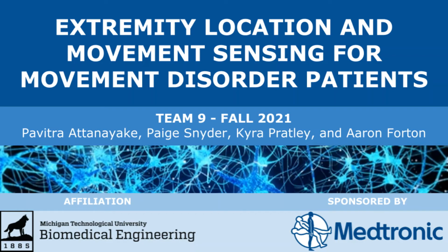Hello, we are Team 9 of Michigan Technological University Biomedical Engineering Department's senior design teams. Our project is titled Extremity Location and Movement Sensing for Movement Disorder Patients.